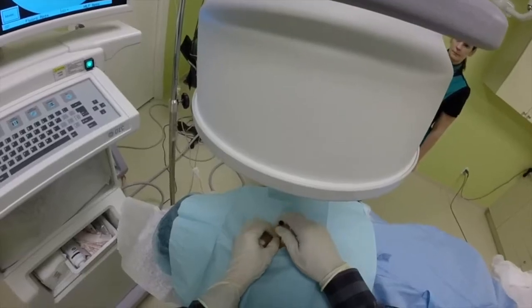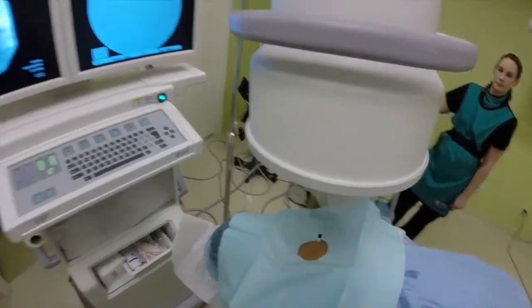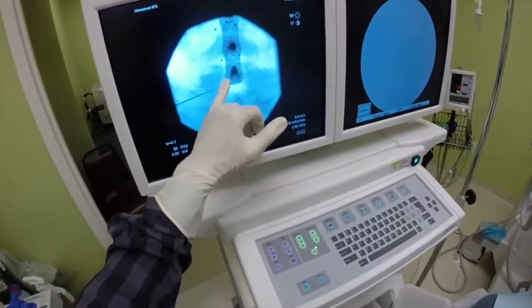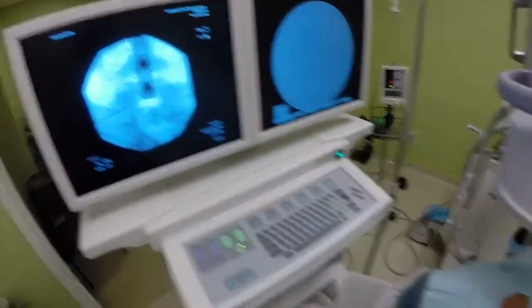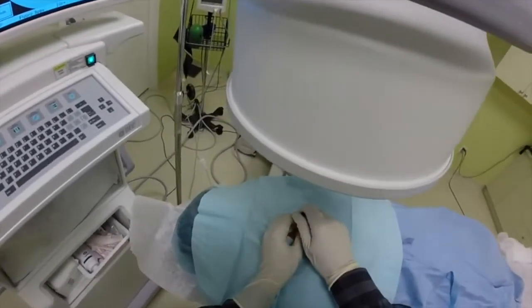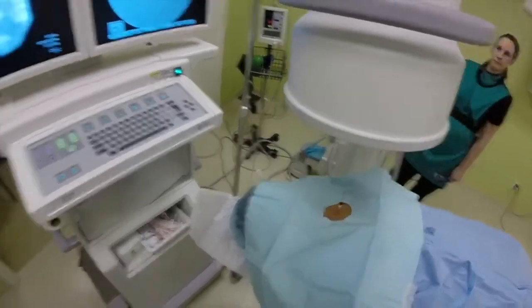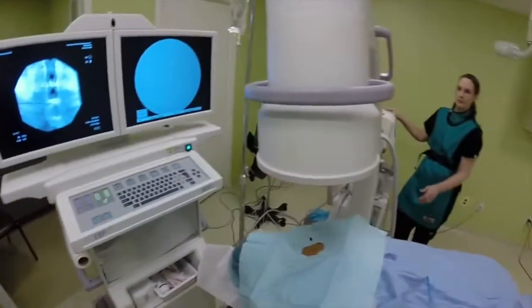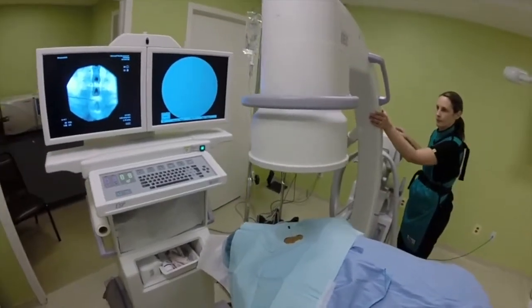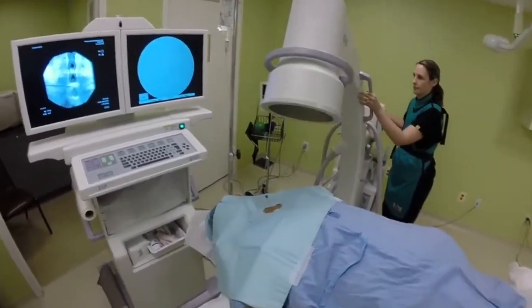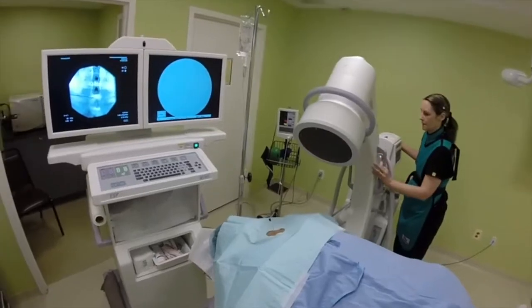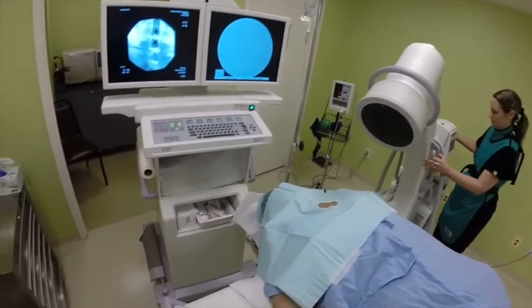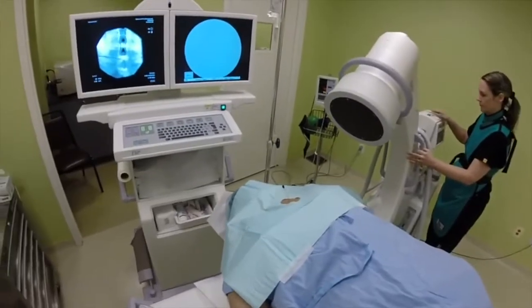You are going to feel another needle. I see my needle going between C7 and T1. We are going to go for a contralateral oblique fluoroscopy now. With contralateral oblique fluoroscopy, the image intensifier moves away from the needle and the X-ray tube moves towards the needle.